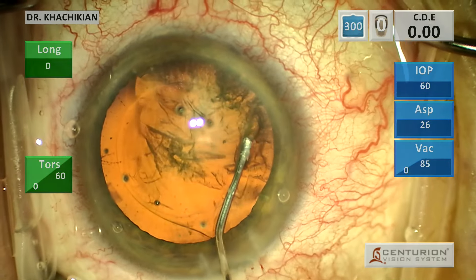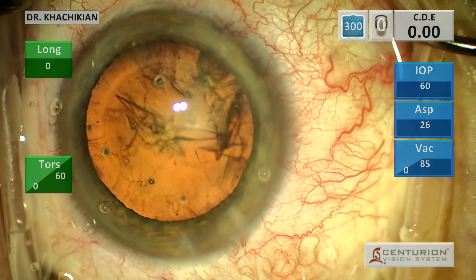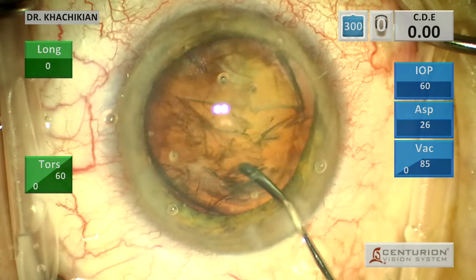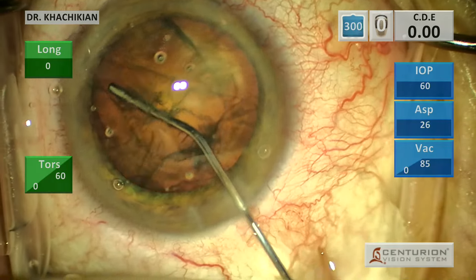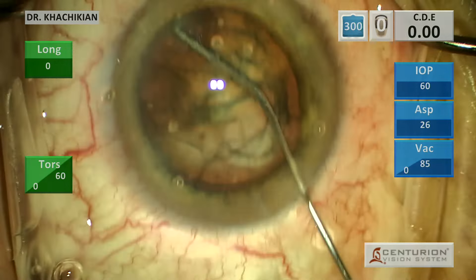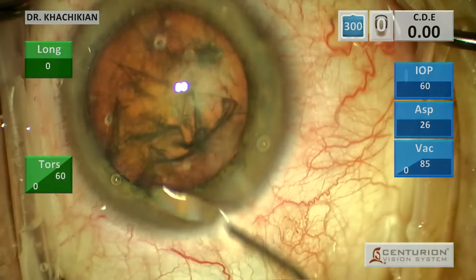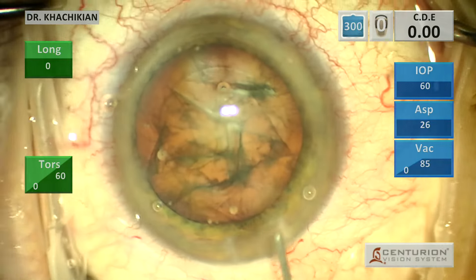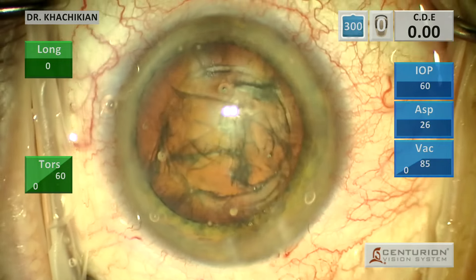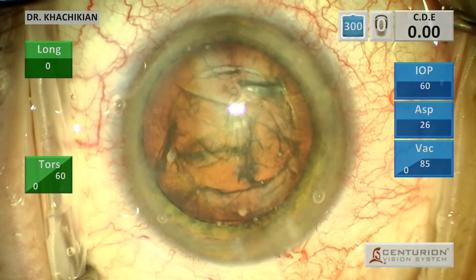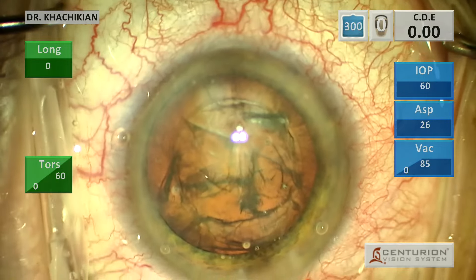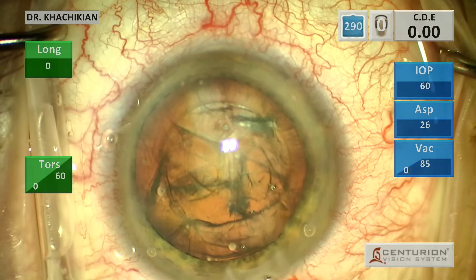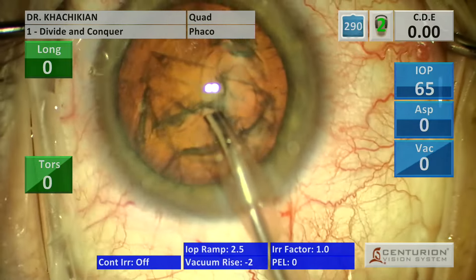We'll do our hydro dissection and a little bit of hydro delineation and we'll get that lens to spin. There you can see the hydro delineation wave. A little more viscoelastic is usually what we'll do, and then the FACO handpiece. Make sure you test the FACO handpiece before you put it in the eye.